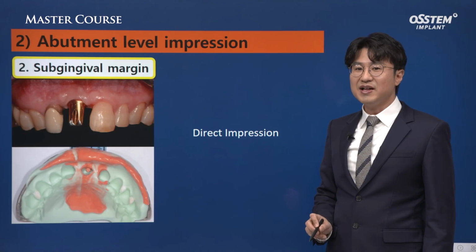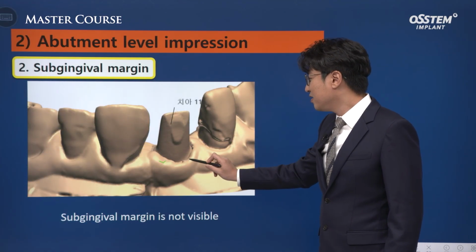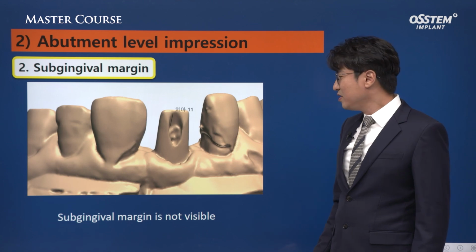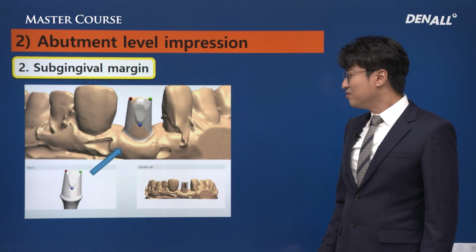Even with the abutment level impression taking, regrettably the margin is not visible. The subgingival margin could not be obtained with impression taking. With the trimming, the margin is not made clear.